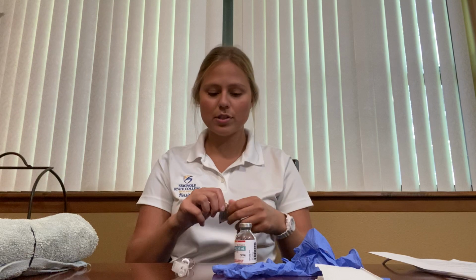It's a multi-use vial. If it was brand new and I was opening it for the first time, I would time, date, and initial it. It's already been open, so I'm just going to be cleaning the rubber stopper with an alcohol pad for 30 seconds. Okay, discard that.